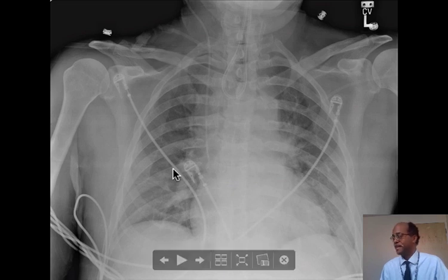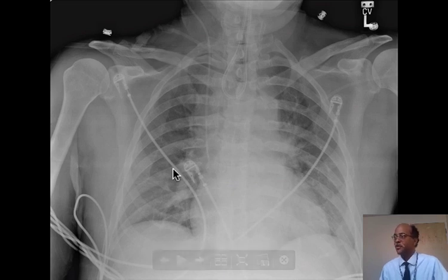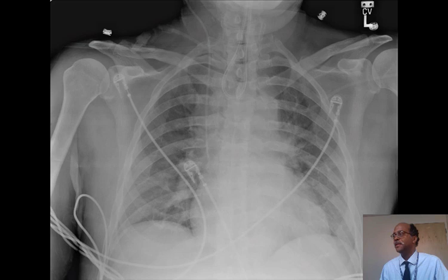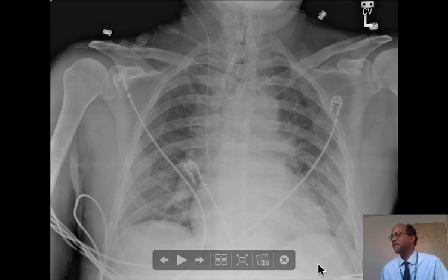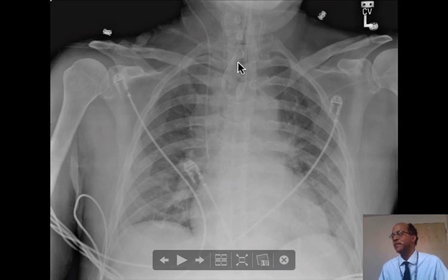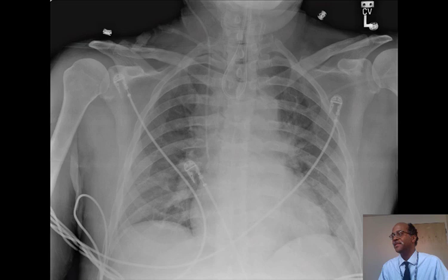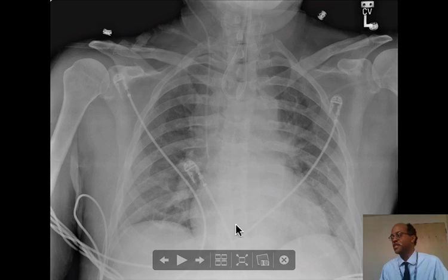Do you see the misplaced tube? They tried to put in a nasogastric tube. The tube should continue all the way down and into the fundus of the stomach. We can see here that it's actually become coiled in the proximal esophagus and pharynx. So you'd rather not feed a patient through this tube. Every time you've placed a line or a tube, you need to confirm its location.